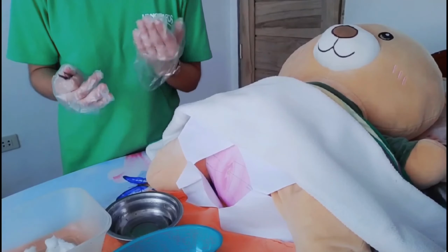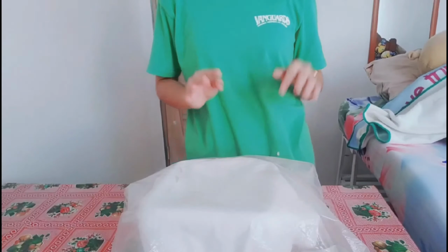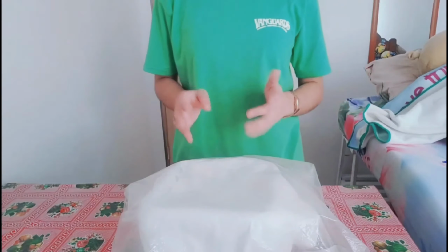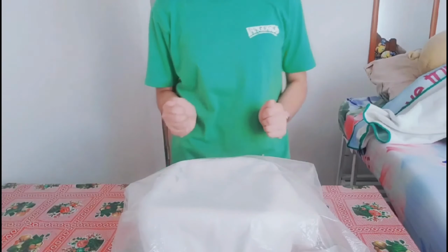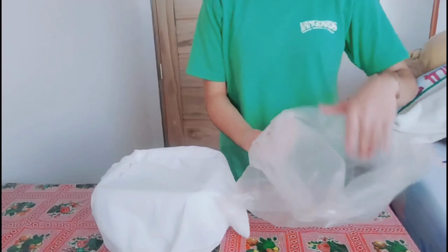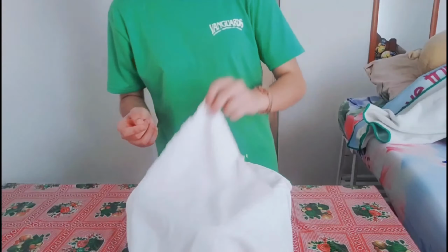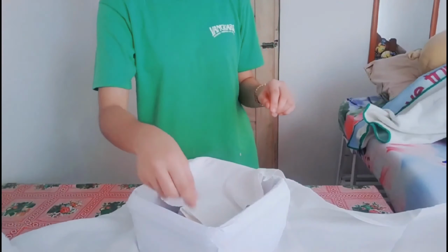After that, we are going to perform hand hygiene again. Open the sterile catheterization tray on a clean overbed table using sterile technique. Placement of equipment near the work site increases efficiency, and sterile technique protects the patient and prevents the spread of microorganisms. In opening this sterile kit or box, first open away from you, then the sides, then toward you.